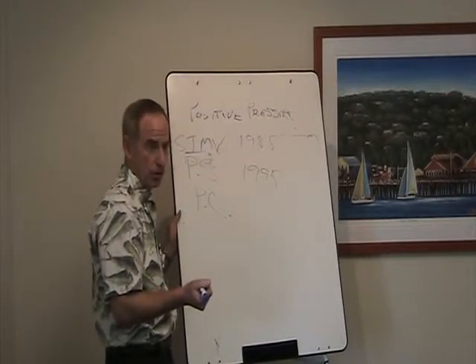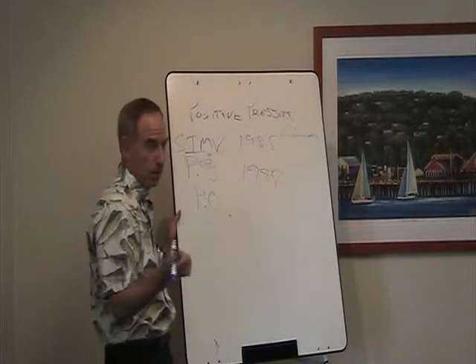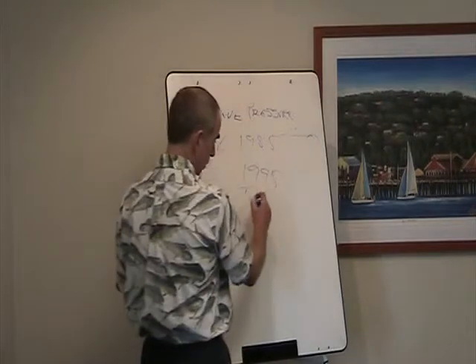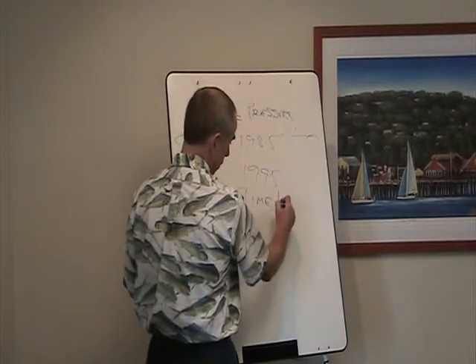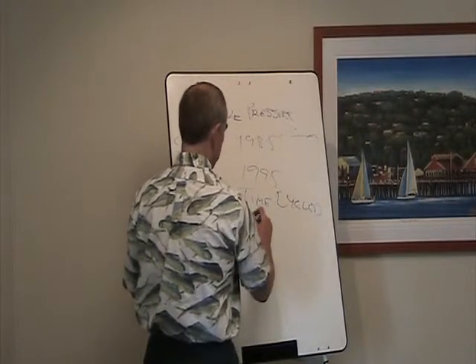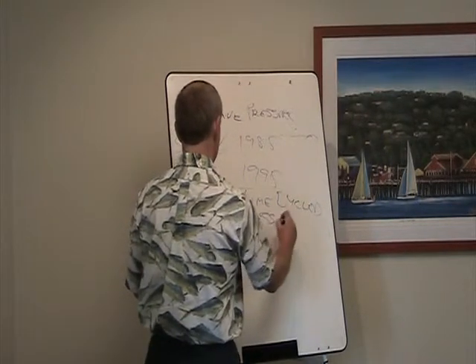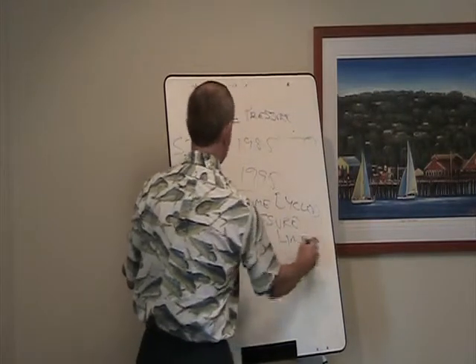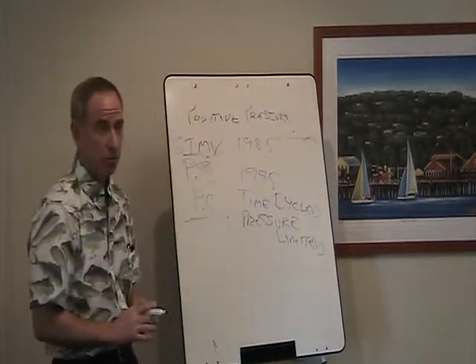You've heard of pressure control, probably, no? Maybe? Okay. All right. Pressure control is time limited, or time cycled, sorry. It's pressure limited. So what does that mean? Well, that means you set a pressure, just like with pressure support.